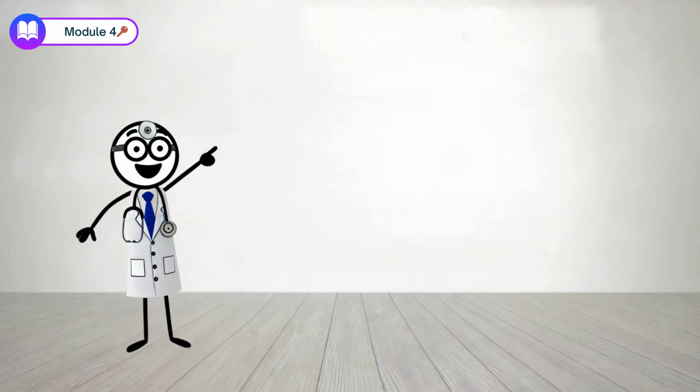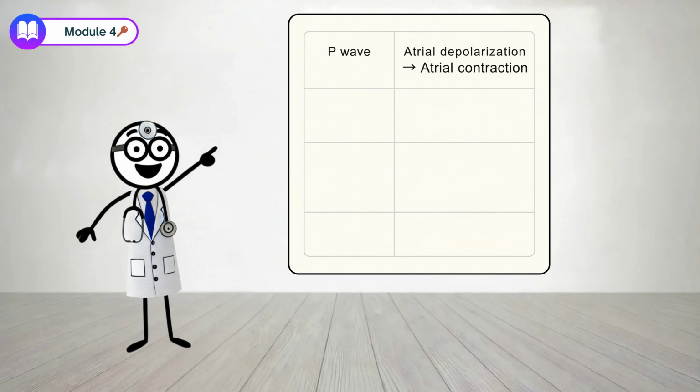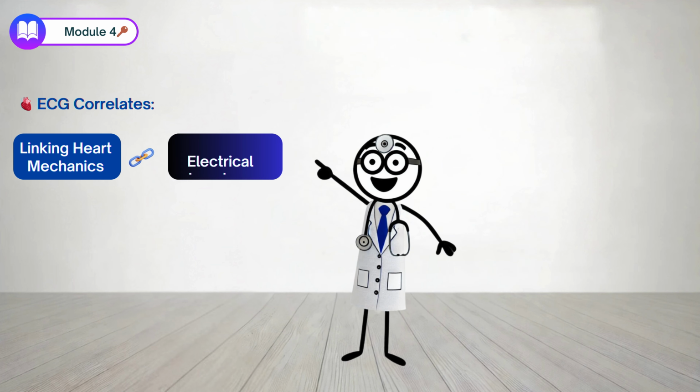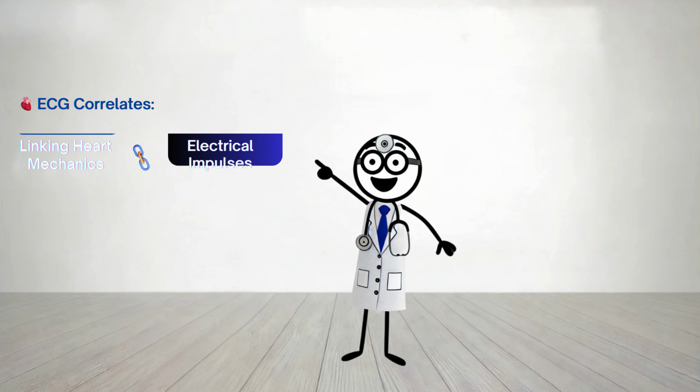Let's quickly summarize the key links. P wave, atrial depolarization, atrial contraction. PR interval, AV node delay, ventricular filling. QRS complex, ventricular depolarization, ventricular contraction. T wave, ventricular repolarization, ventricular recovery. Each phase is critical and each abnormality gives you a vital clue about what might be wrong inside the heart. In this session, we connected the dots between the electrical patterns we see on the ECG and the physical, mechanical actions inside the heart.